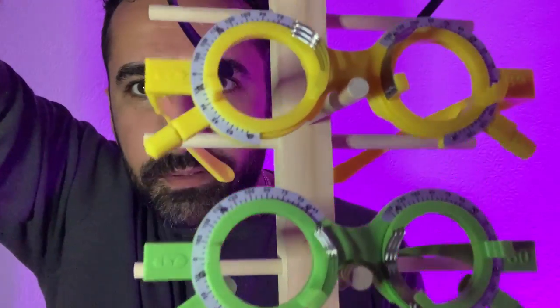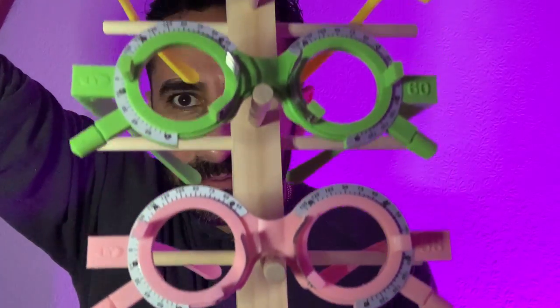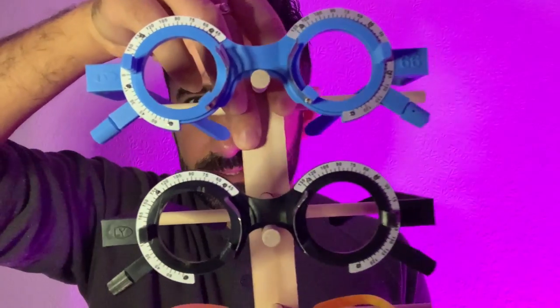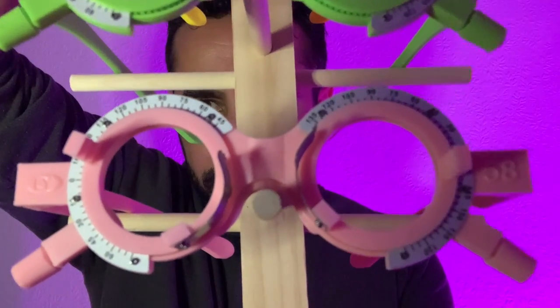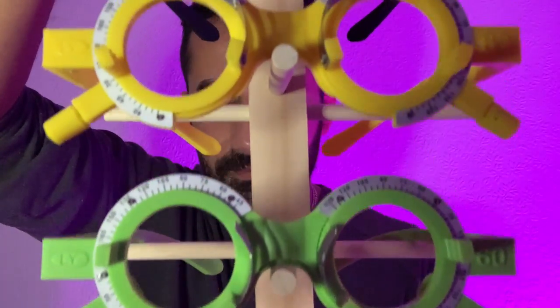First up, say hello to a set of five brightly coloured varying optical centres trial frames. Starting at the top we have the 66mm setting; we drop down in two millimeter increments depending on your pupillary distance, so we can have your optical centre lined up with the centre of the frames.